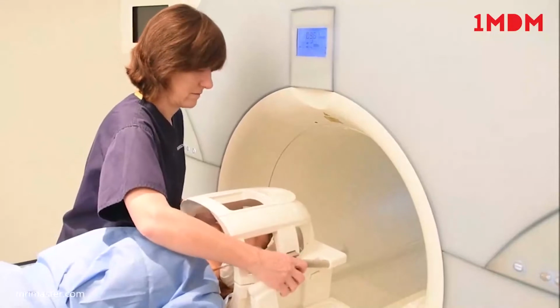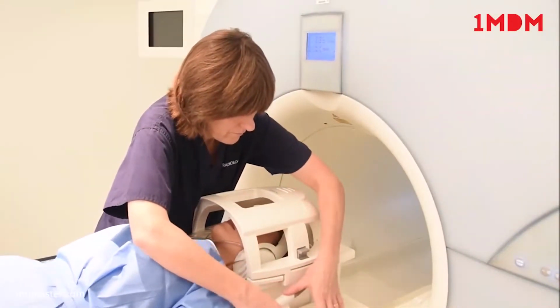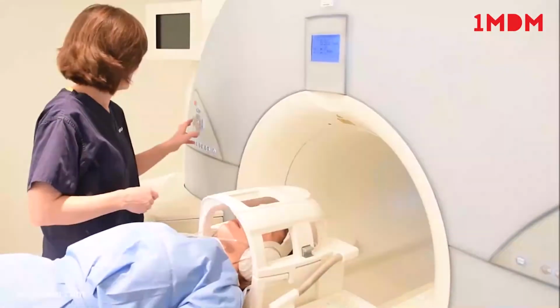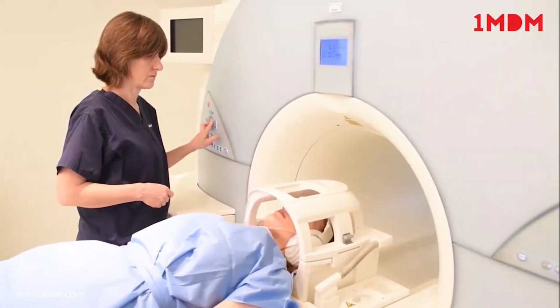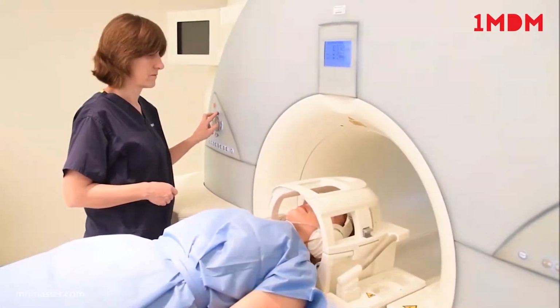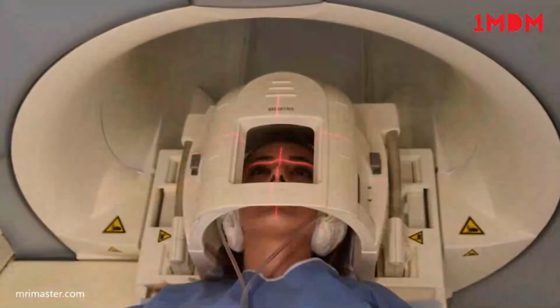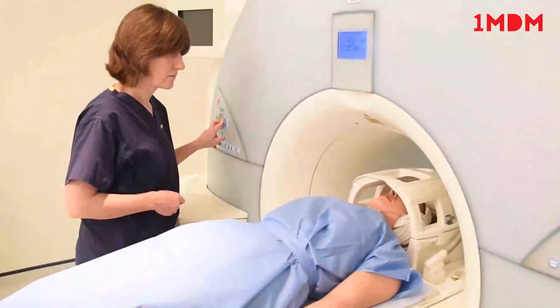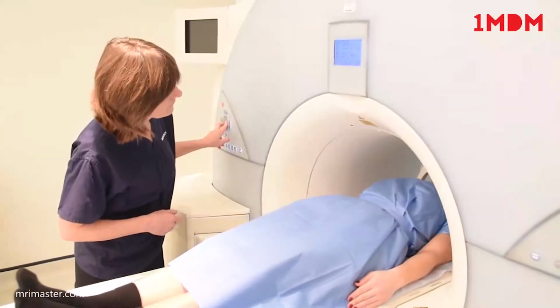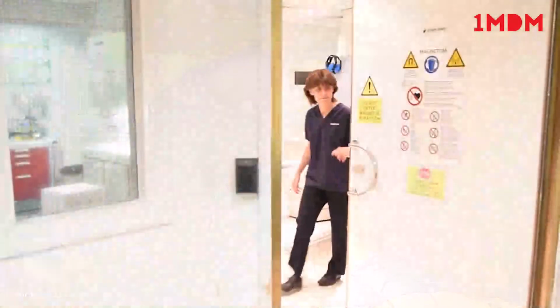Attach the head coil. Move the patient carefully into the scanner and center to the glabella. Now move the patient fully into the scanner. Make sure the patient is calm and comfortable before leaving the room.